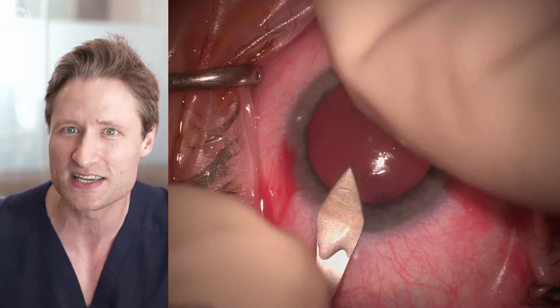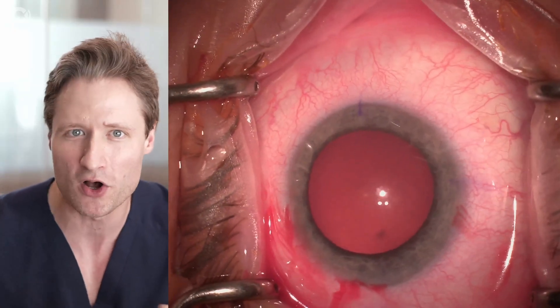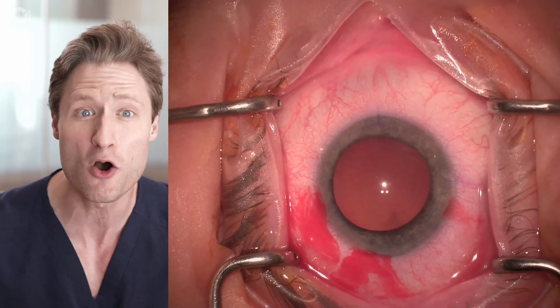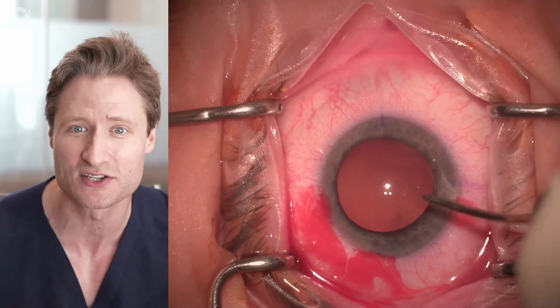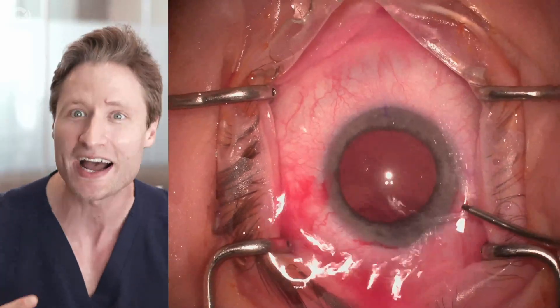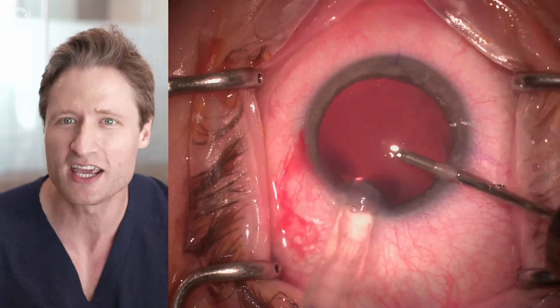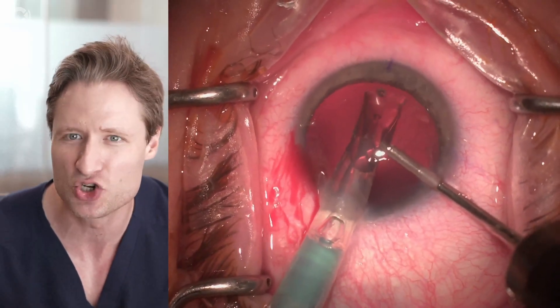This is a three-millimeter steel keratome, and I'm making this incision temporally to place the lens inside the eye. I pump up the volume with a little preservative-free lidocaine to maintain the chamber. We like to deliver this lens with no viscoelastic — that way you don't have to remove it at the end or risk leaving it behind and getting pressure spikes post-operatively.